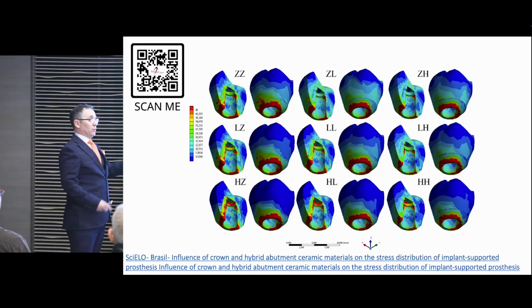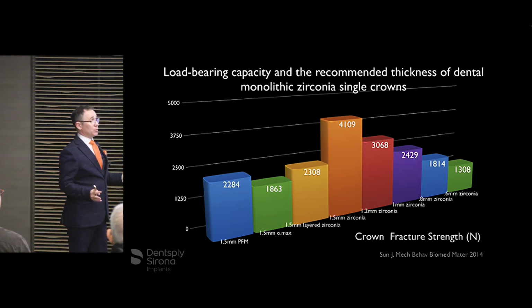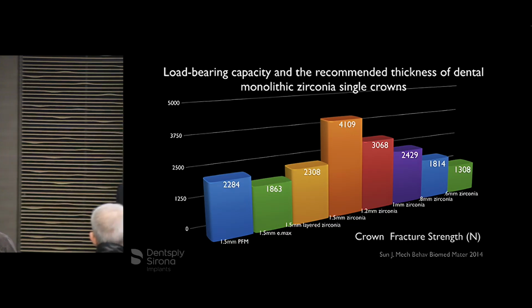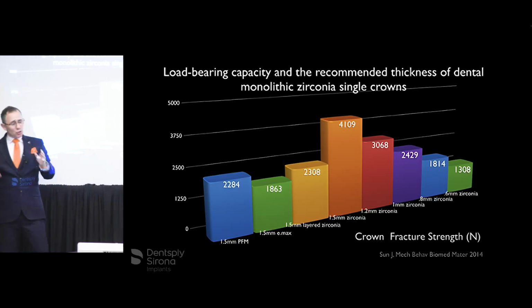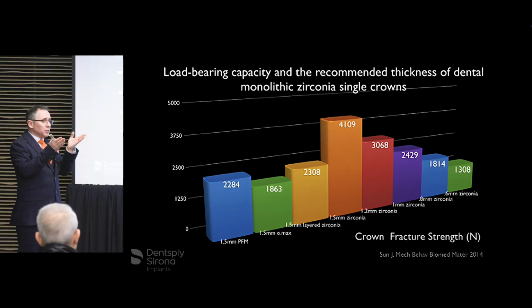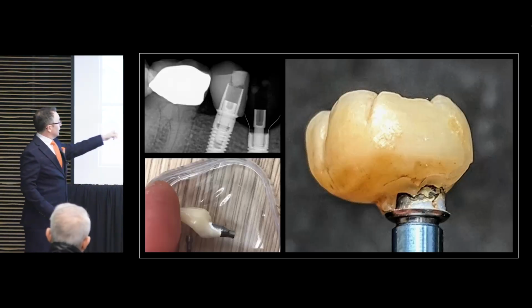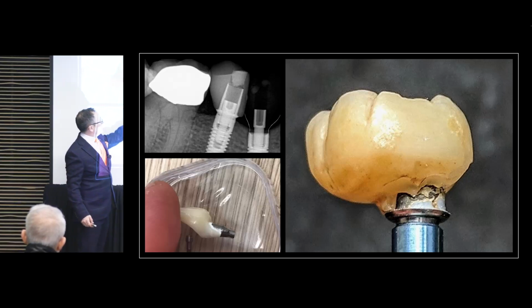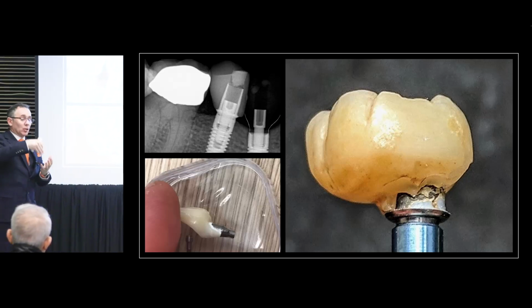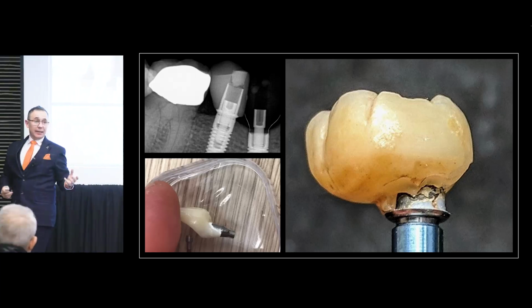So most of the crowns that you'll see, and Martin will show one later, with zirconia, that's where it's always thinnest. Zirconia is an awesome material. We love it. 95% of all our crowns now are zirconia. But when you even take it down by 0.5 mil, you substantially sacrifice strength. So when we've got these narrow little collars, of course that's where it's going to break. So what else was happening with these and these and these? It's all to do with that cantilever loading. That force is happening down here where it's weakest and it's blowing it out.